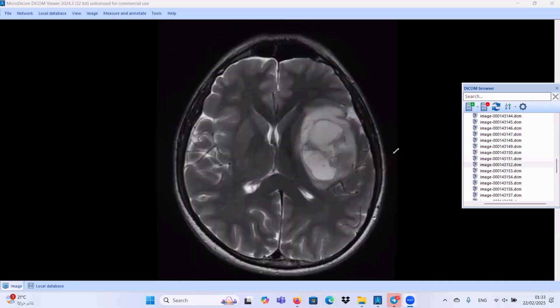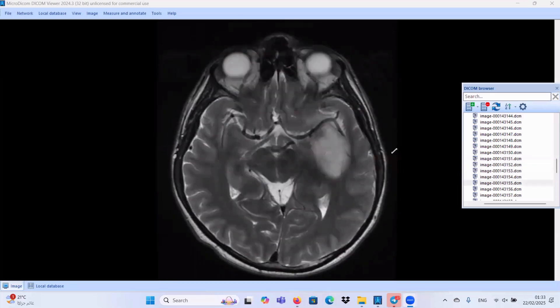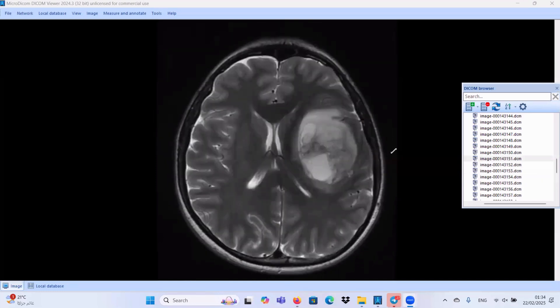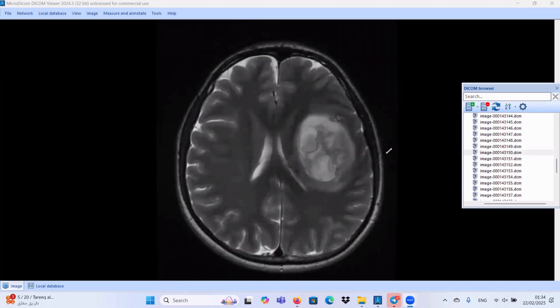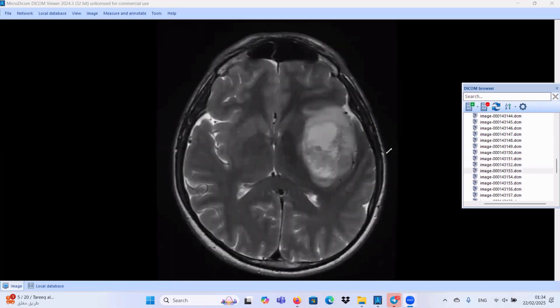We did an MRI study for the same patient. As you see here, we have a complex mass with different components — solid components and cystic components. These are the cystic components, as you see here. And we have also some solid components. So, we are dealing with a complex mass most likely representing a brain tumor, either primary or secondary. We will not go deep in this case.